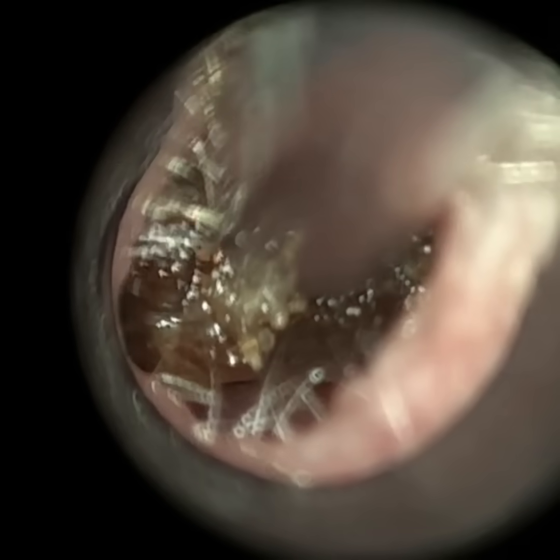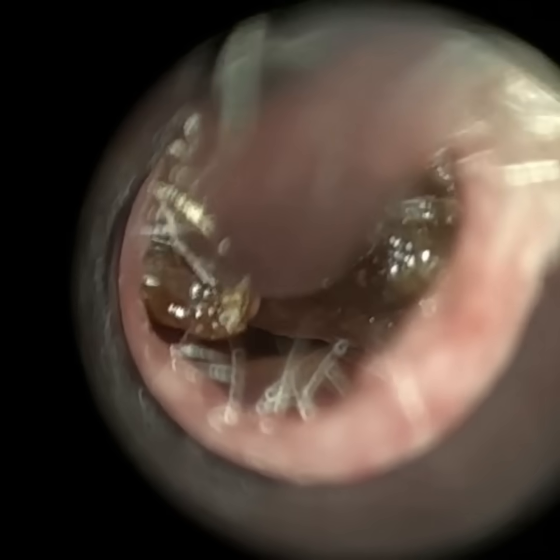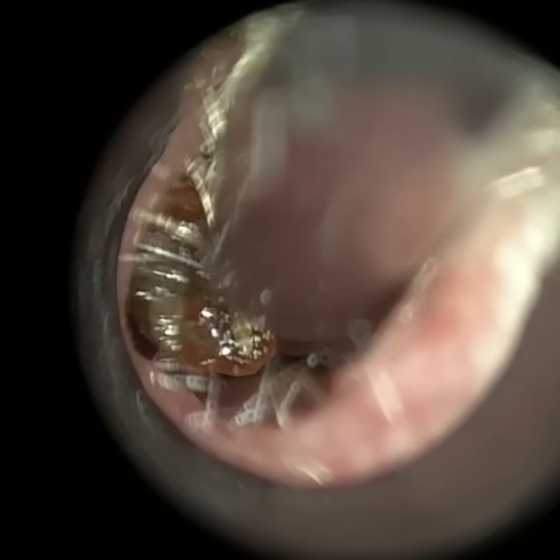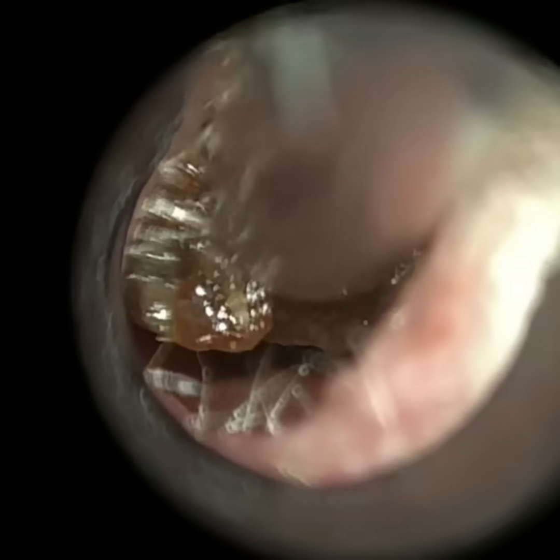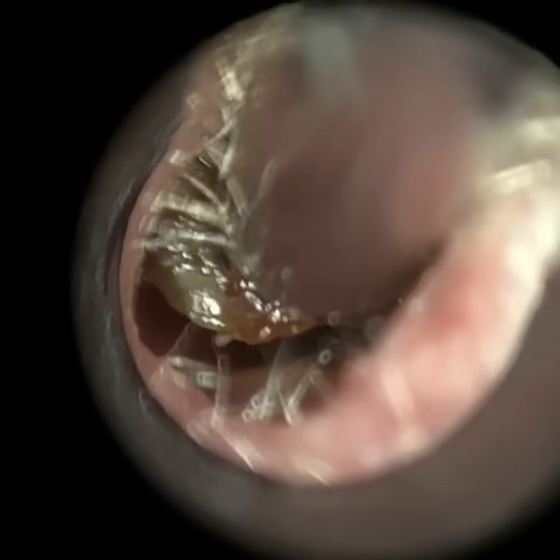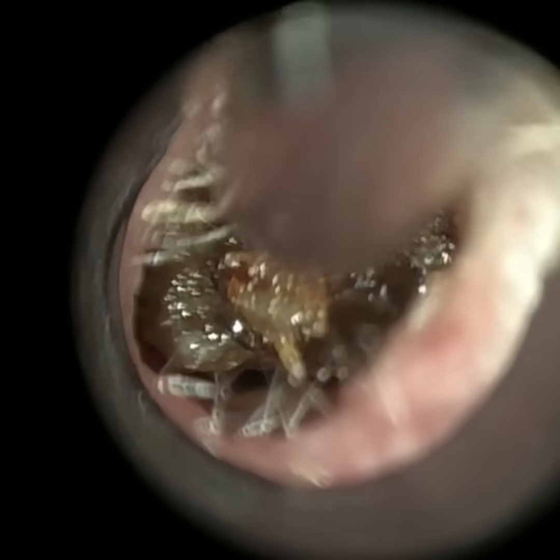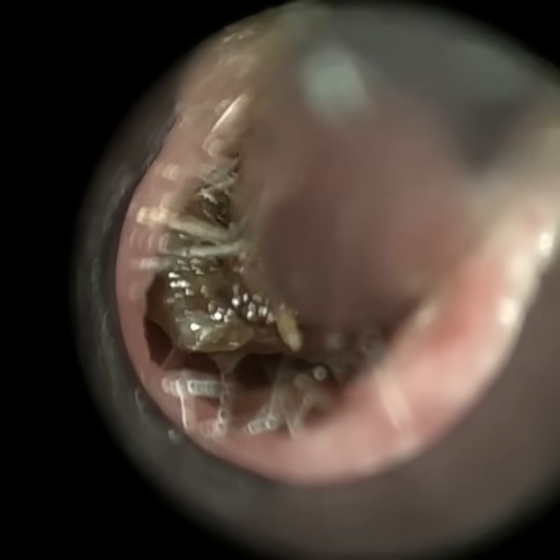That's what's trying to keep the ear canal open. And it's going to come through really, really well in a moment. And I'm going to zoom in as well. So with our WAXscope and with the iCLEARscope, with the app that we use, the ClearWax app that we've developed, it's got a zoom function. So it's going to work really well in a minute.